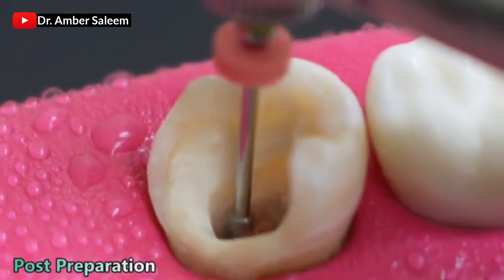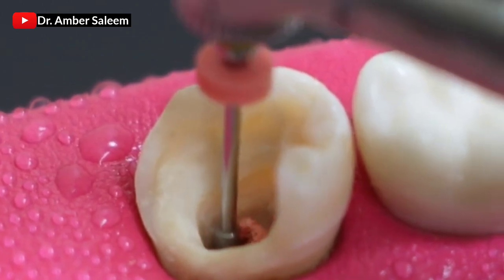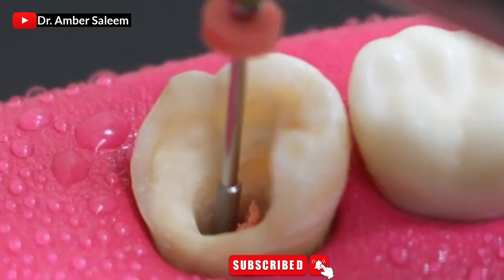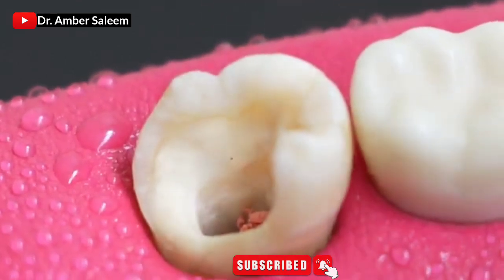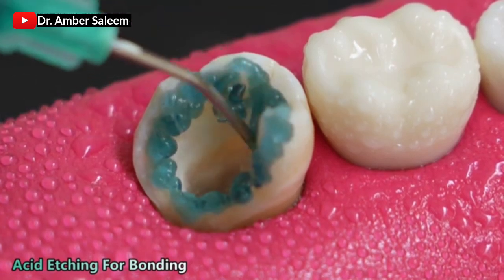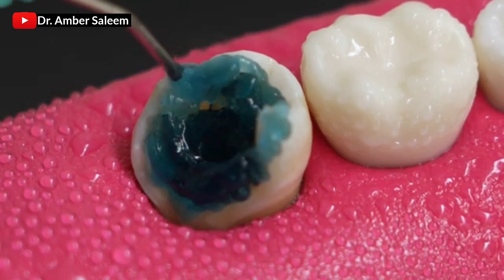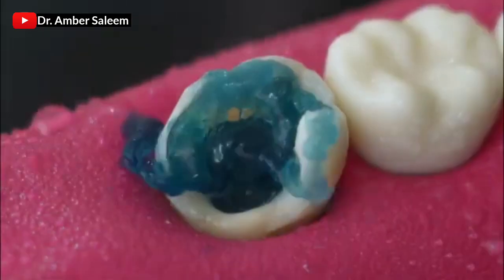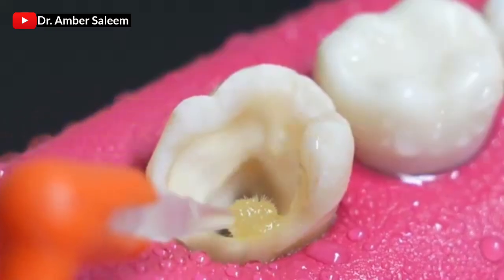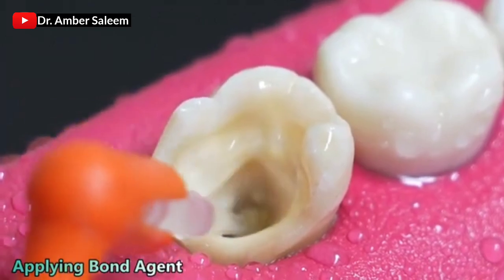Post preparation. Acid etching for bonding. Applying bond agent.